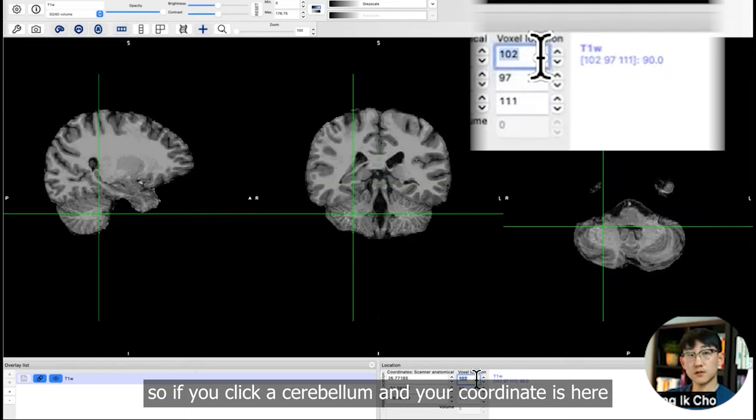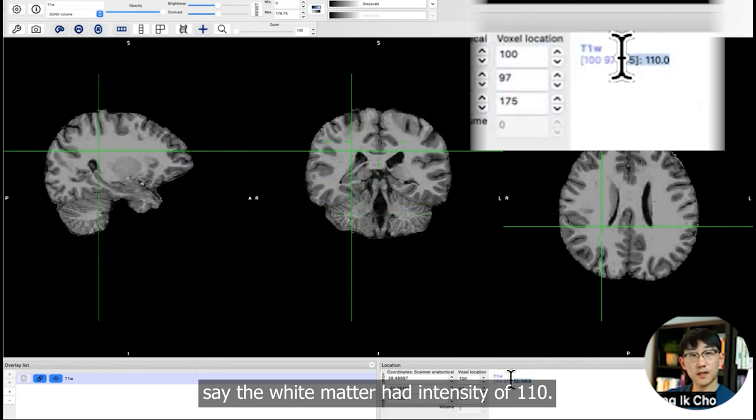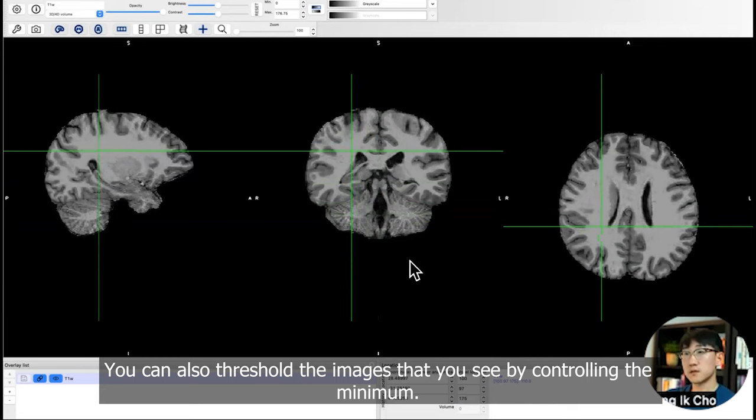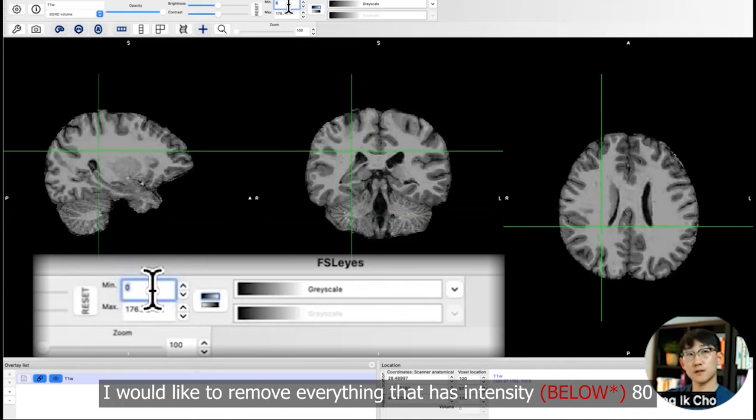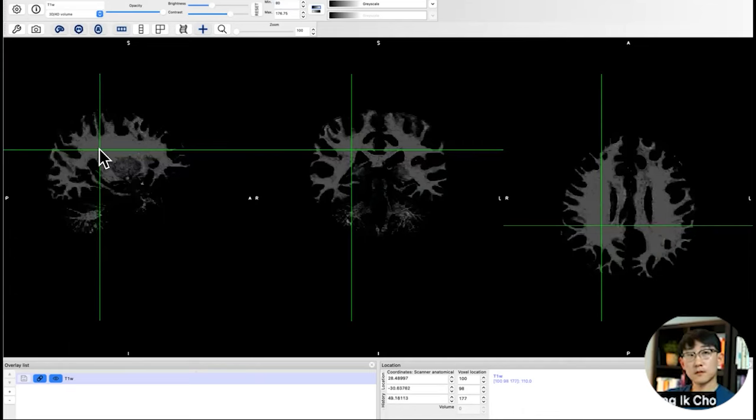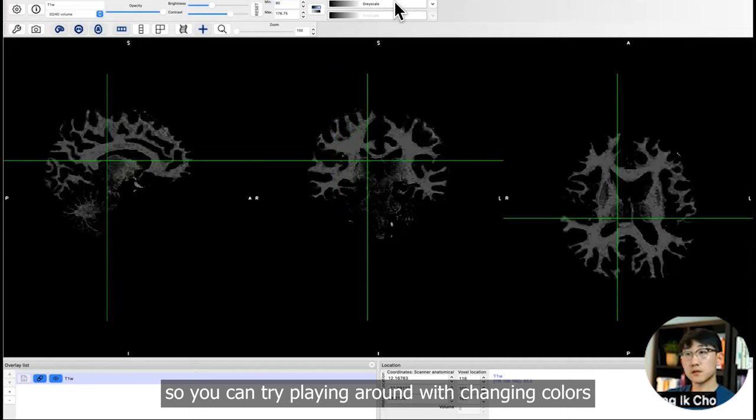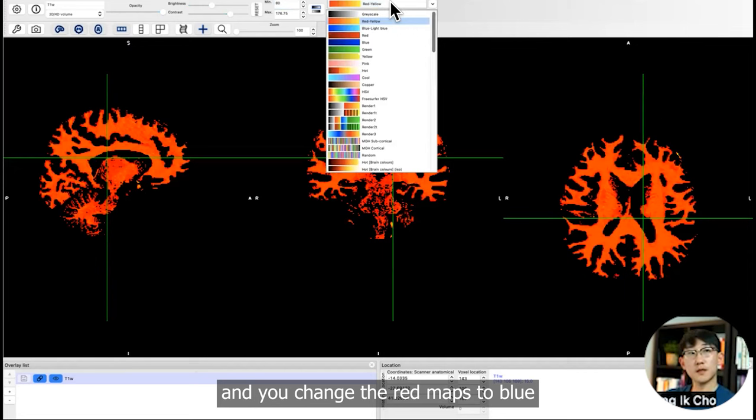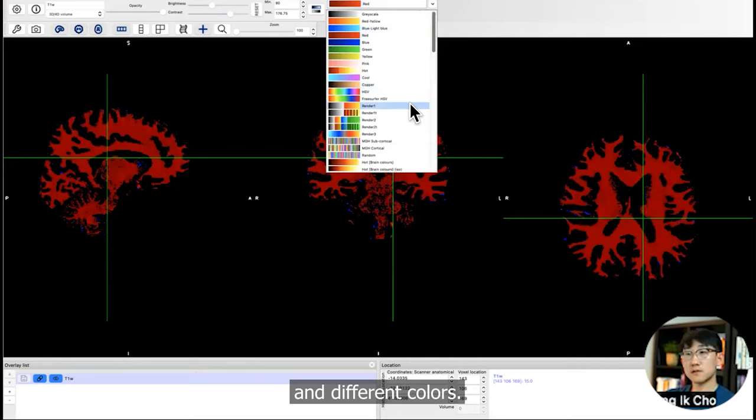So say the white matter had intensity of 110. You can also threshold the images that you see by controlling the minimum. I would like to remove everything that has intensity of 80. And now everything below 80 goes away. You can try playing around with changing colors, red maps, blue, and different colors. But literally, you are working with an array.